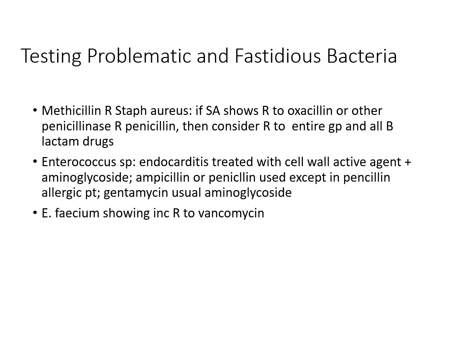For testing problematic and fastidious bacteria, we have methicillin-resistant Staphylococcus aureus, or MRSA. A Staphylococcus aureus that shows resistance to oxacillin or other penicillinase-resistant penicillins should be considered resistant to the entire group of beta-lactam antibiotics.